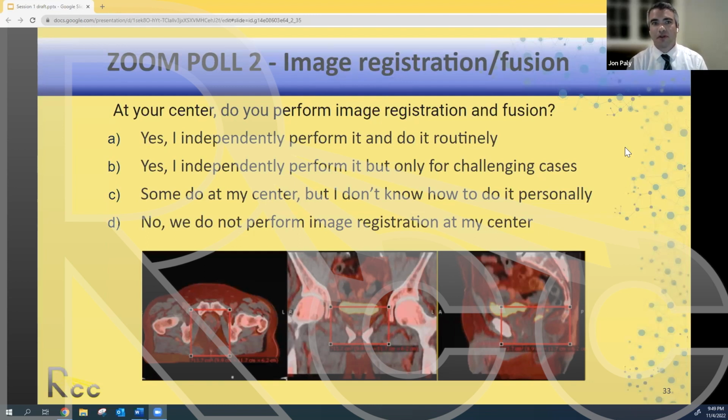Now, sometimes if there is a really bright area in, say, the inferior vena cava that's very full of contrast, it is important to have your dosimetrist or you contour that area and set it to the blood pool Hounsfield unit to make sure that you're not tricking it into thinking it's something denser. But in general, the slight differences in contrast will not affect planning in a significant way. Very good question, if that's what the question was. I think yes, it was. Great. All right.